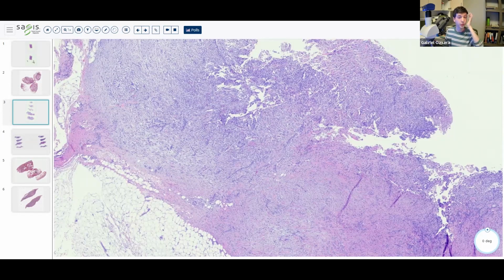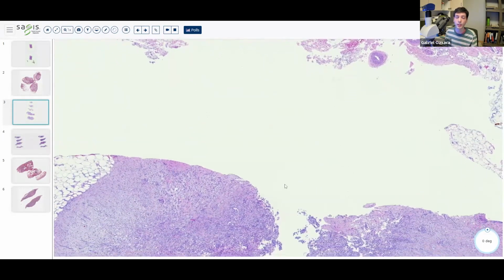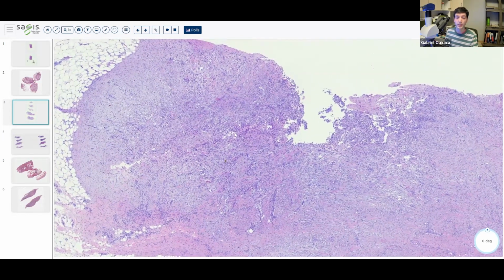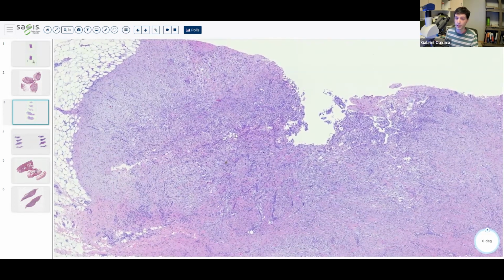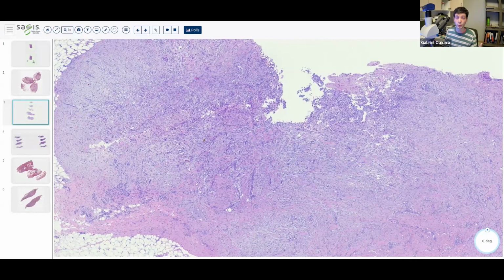If there was concern for other entities, the one immunohistochemical stain that might be helpful, as most of these are typically diagnosed on H&E, is an SMA. The testing of these with immunohistochemical stains is usually in cases that are much more cellular, and the secondary features, which I pointed out, aren't as readily apparent. What an SMA is going to stain is not the fact that it's a smooth muscle tumor, because it's not. This is a fibroblastic myofibroblastic proliferation; SMA stains the contractile units within the myofibroblast.